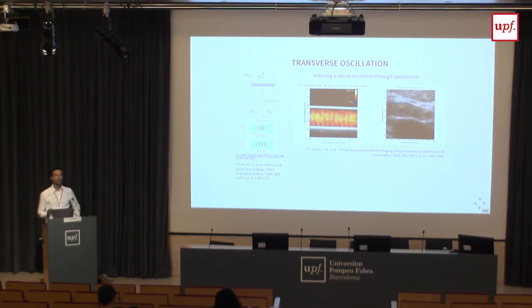If you want, you can think of this intuitively in a different way. What we are doing here is exciting these elements and not these elements. So it's like if you had two transducers, one here and one here. So you are measuring from two directions and then you are resolving a vector. So what is happening is what I said first. This is just the intuition behind it.